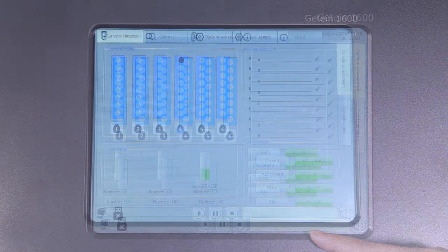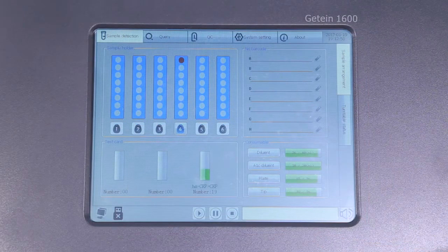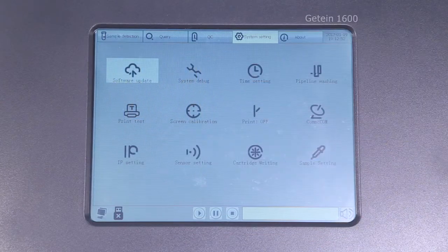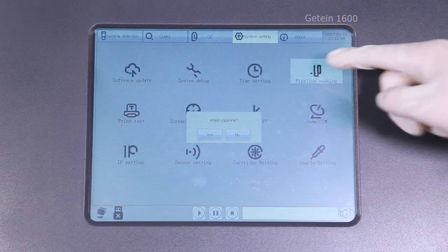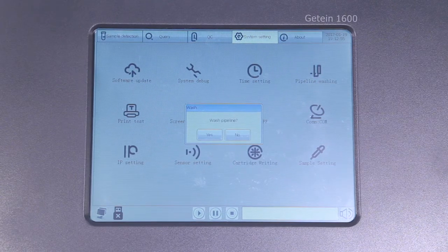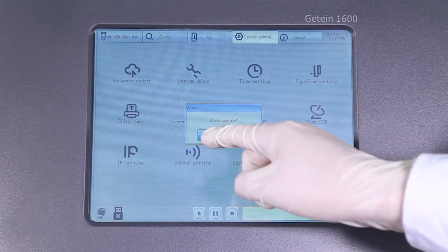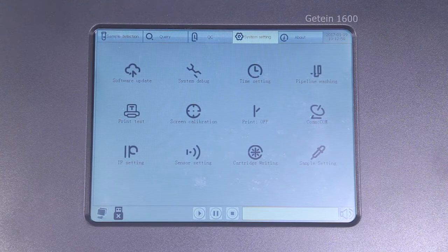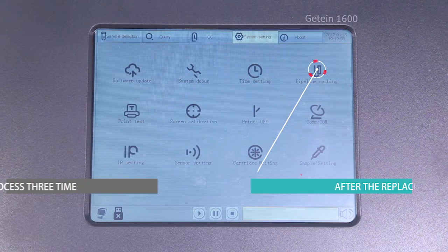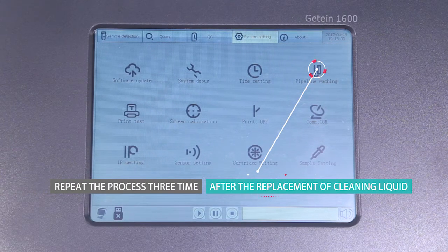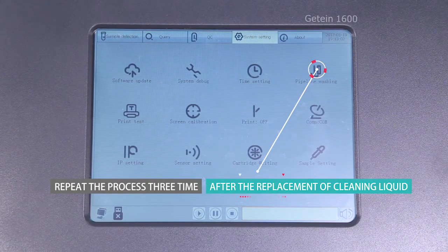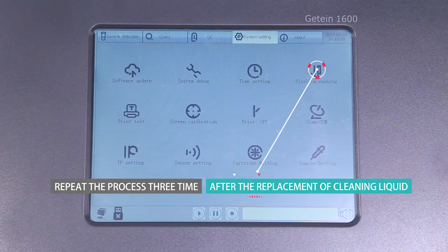It is recommended to wash pipeline before daily use for good performance. Click pipeline washing in the system setting interface to do the cleaning. Repeat the process three times after the replacement of cleaning liquid.